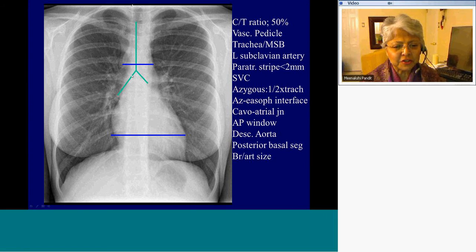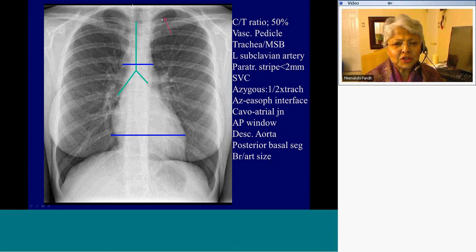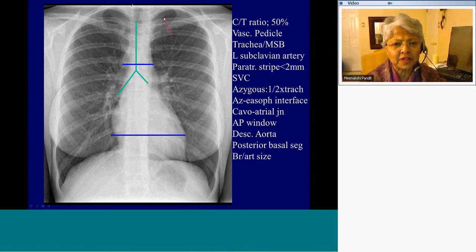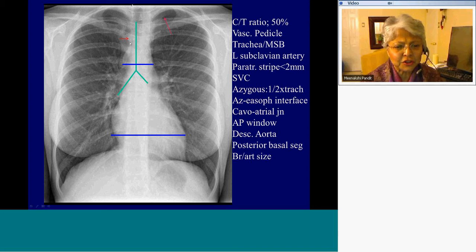You must be mindful of the orientation of the trachea and the main stem bronchi, and remain mindful of the fact that the right main stem bronchus is more vertical than the left. This is a curved interface caused by the left subclavian artery as it courses over the left apex, over the left first rib. This is the paratracheal stripe — not quite as well delineated, but it should not be more than two millimeters in thickness.